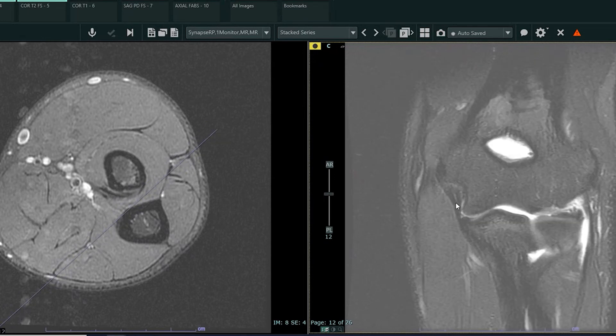Ligaments on MRI are typically black — they're dark — and ligaments hold or give stability to joints. In this case, with the throwing athlete, especially in the late acceleration phase of throwing, this ligament has a large amount of stress on it. And if there's too much stress or too much repetitive stress, this ligament can tear.